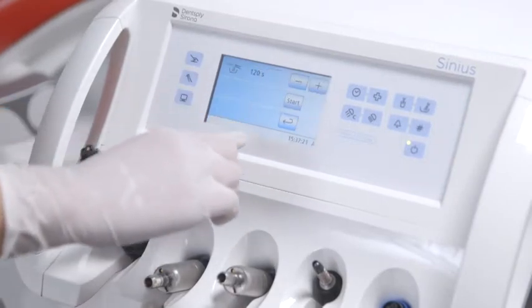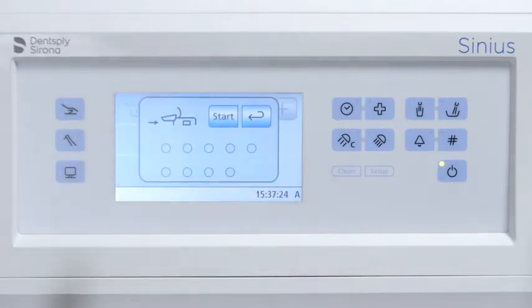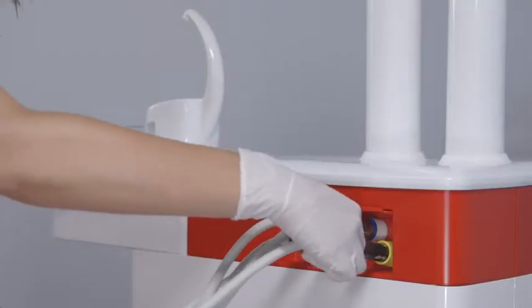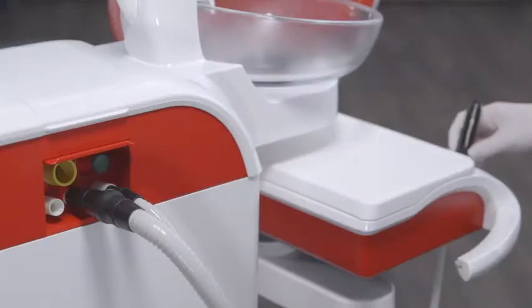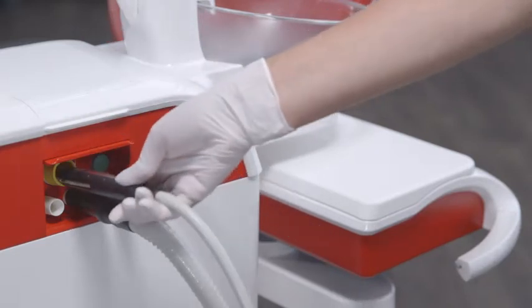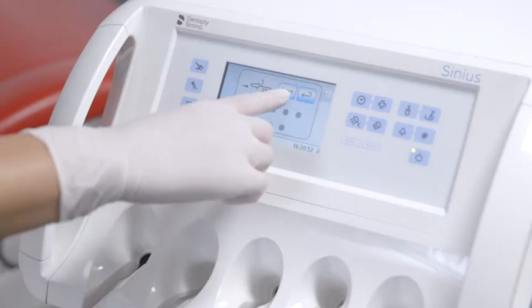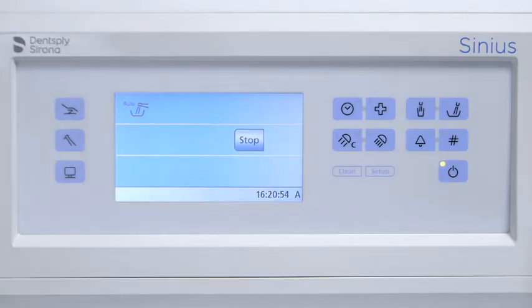Use the auto purge function to flush the water lines in the morning and evening. Attach the instrument hoses of the dentist and assistant elements and the suction hoses to the designated adapters in the water unit, and then press start. The instruments that are removed from the holders are flushed for the set time and the suction hoses are cleaned.